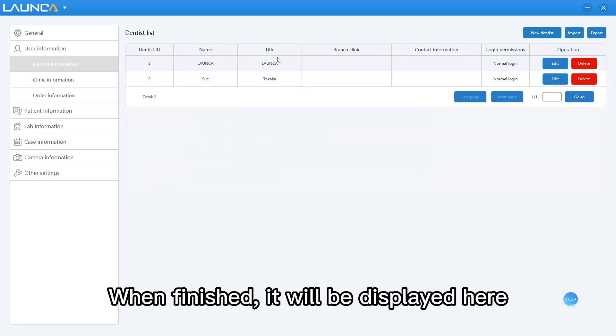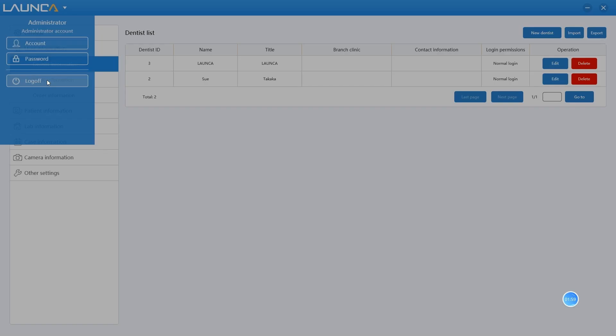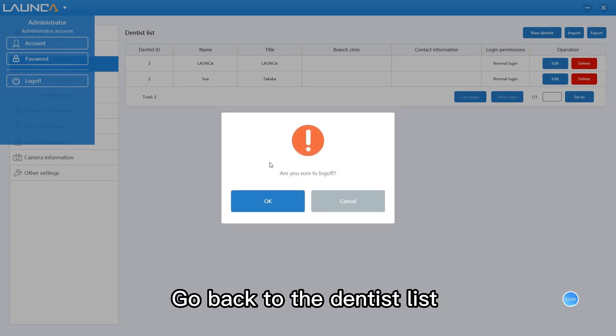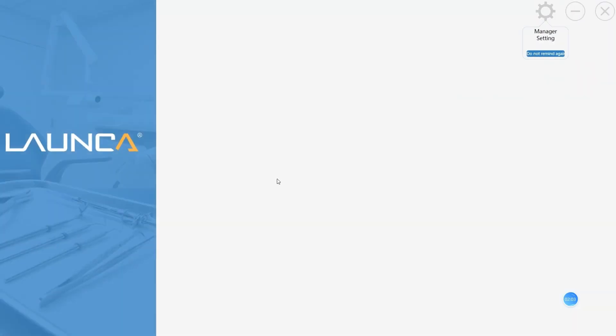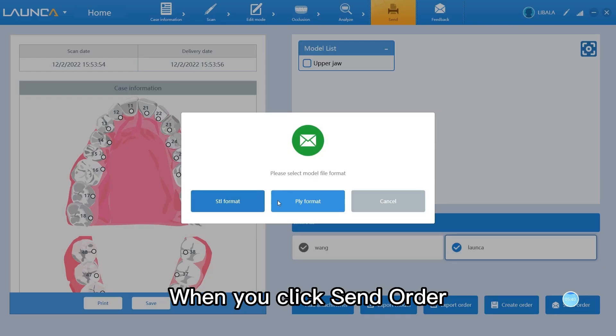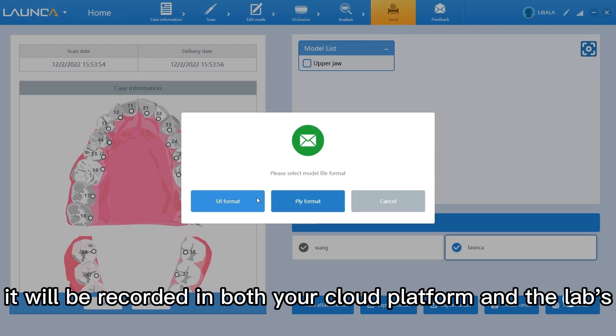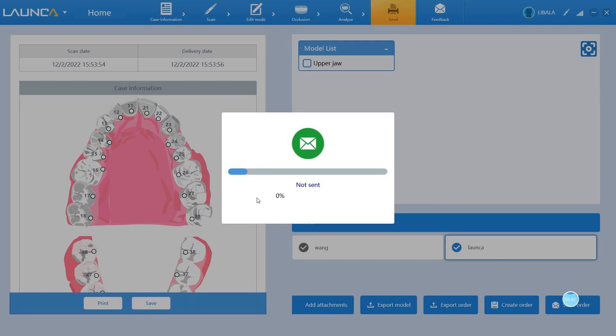Click save. When finished, it will be displayed here. Go back to the dentist list and you will see the dentist account. When you click send order, it will be recorded in both your cloud platform and the labs.